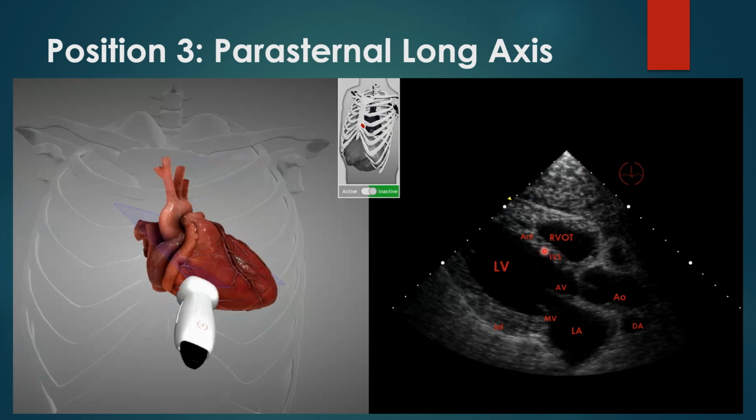But you can look at the anterior wall, inferior wall, you can look at the ventricular septum. If you've got some type of septal hypertrophy, you've got it right here in this septum, and usually this septum is nice and big.